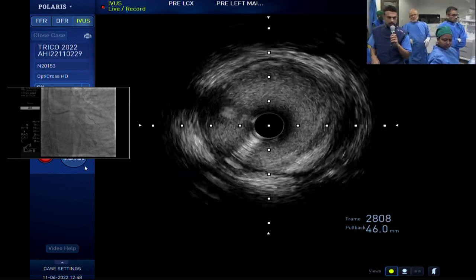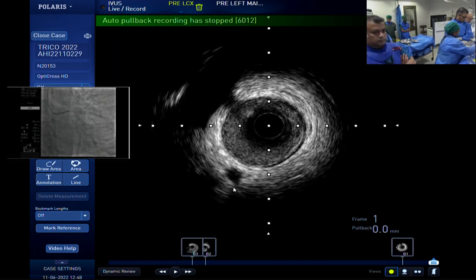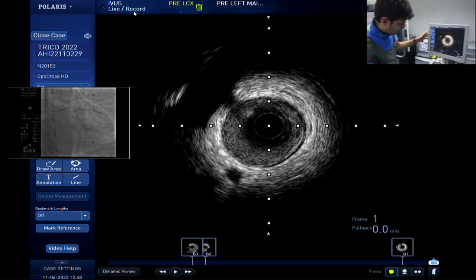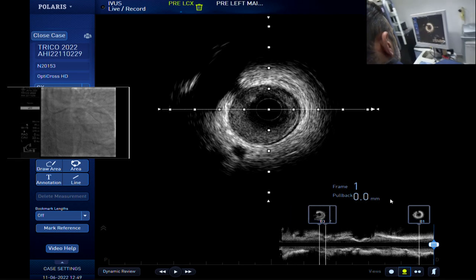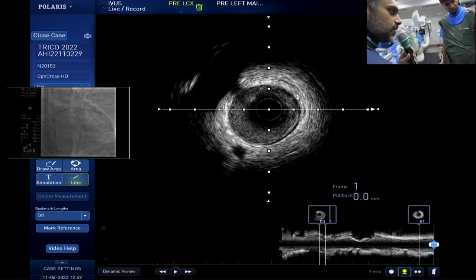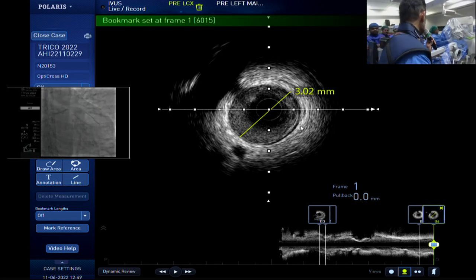And how do you decide the length? You can stop and take it out. So let's look at the IVUS now and we'll make a decision. Right? So this was the point of really engaging the IVUS well, right? So that your length measurement is clean. So here's your distal landing zone, right? You see that it's a largely disease-free distal landing zone. And if you're going to measure EEL to EEL, this is a 3 millimeter vessel, distally, okay?